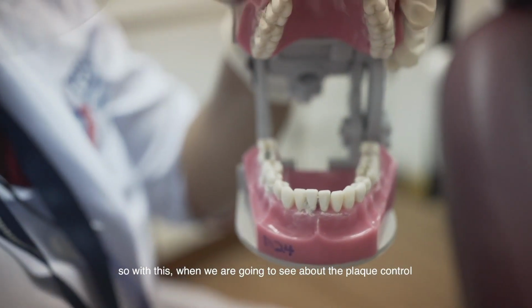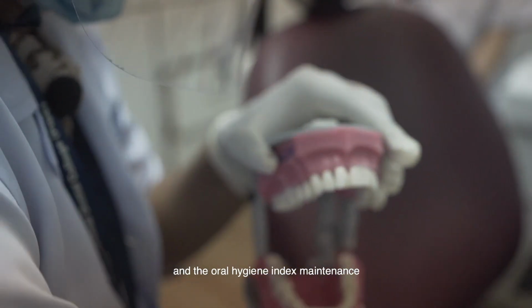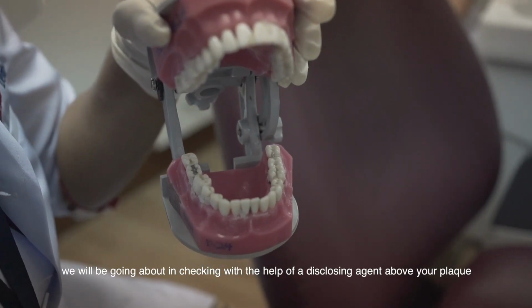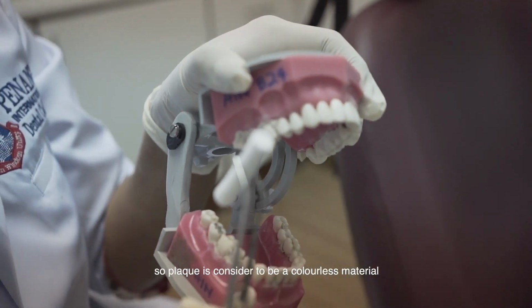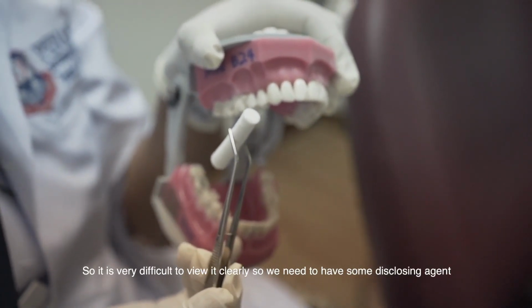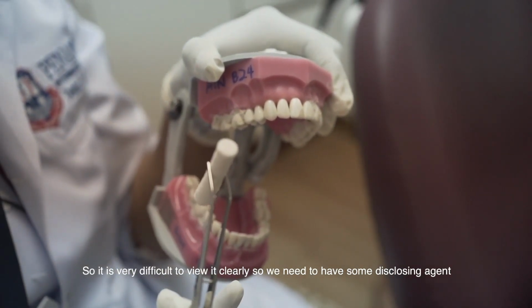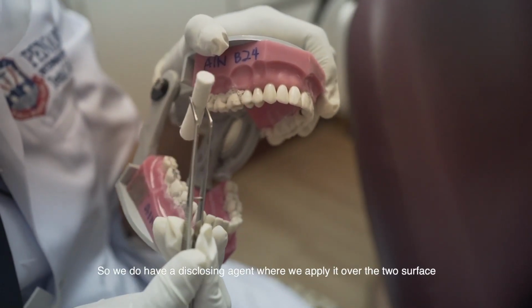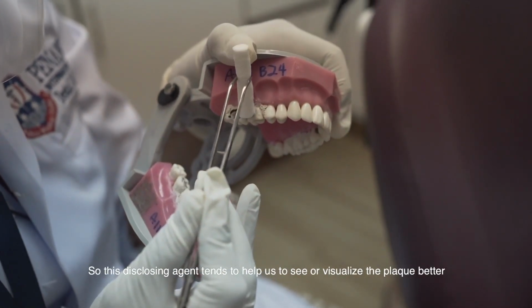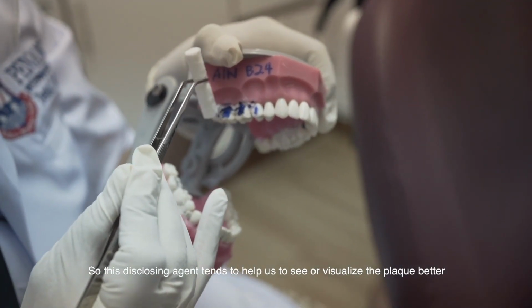So with this, when we are going to see about the plaque control and the oral hygiene index maintenance, we will be checking your plaque with the help of a disclosing agent. Plaque is considered to be a colorless material, so it is very difficult to view it clearly. So we need some disclosing agent to make us view it correctly, which we apply over the tooth surface. This helps us to visualize the plaque better.